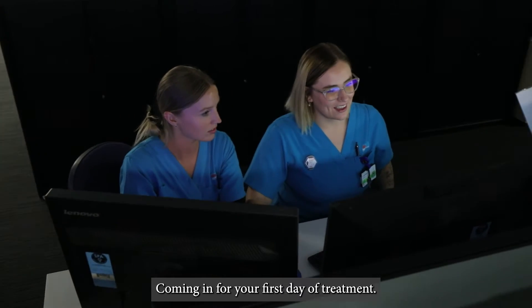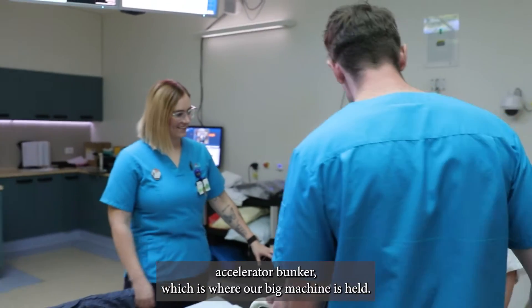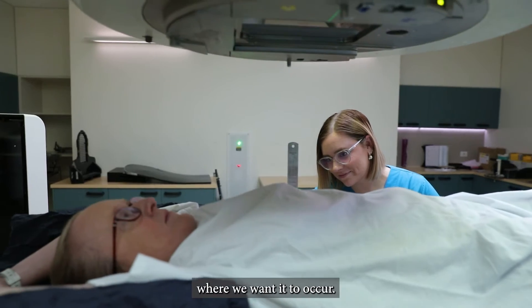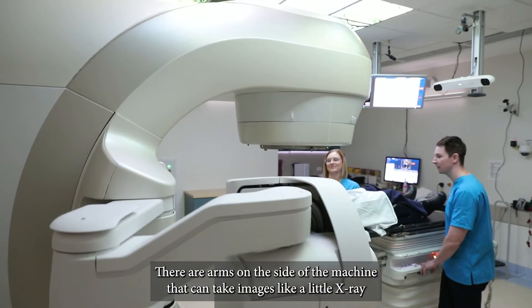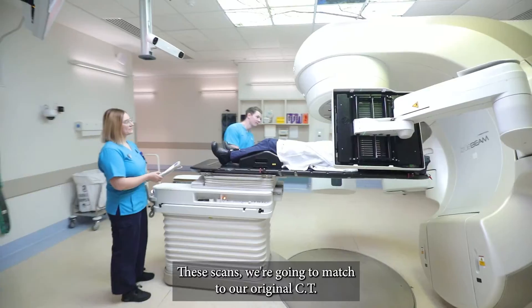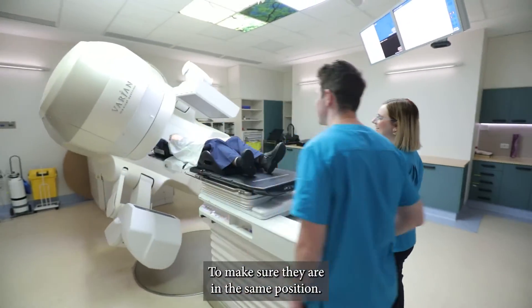Coming in for your first day of treatment, we'll bring you into what we call a linear accelerator bunker, which is where our big machine is held. There is a large head at the top that produces the treatment itself and shapes the dose into exactly where we want it. Arms on the side of the machine can take images — like a small x-ray or a mini CT scan — to make sure the patient is in exactly the right position, matched to the original CT.